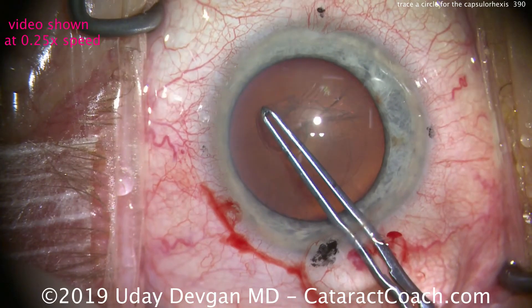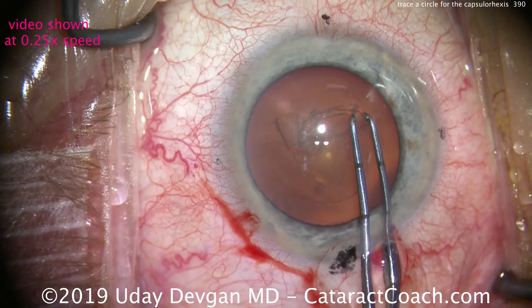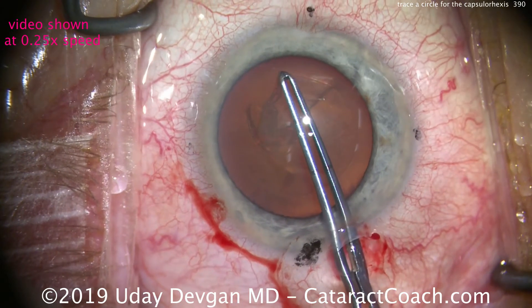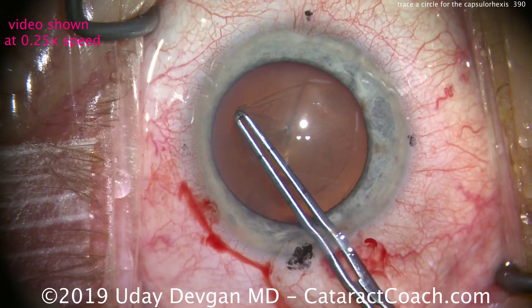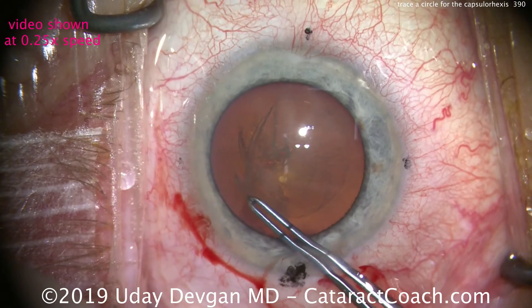Look at that. One more re-grab on this point — the tips will trace that rhexis. Grab the tips here, trace the circle with the tips, and then the capsular rhexis follows nice and easy. Care is taken to pivot within the incision so we don't distort the tissues.